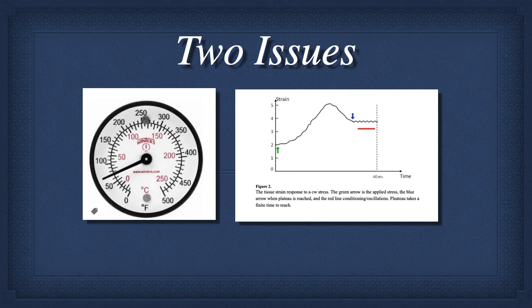oh crap moment, because when you apply a pressure to a tissue like an artery, we all sort of assume the tissue changes instantaneously. And it turns out, if you're at 30 frames per second, the tissue does not hit steady state till roughly 1 frame. So most of the measurements you're taking, it's changing in a dynamic and unpredictable way.